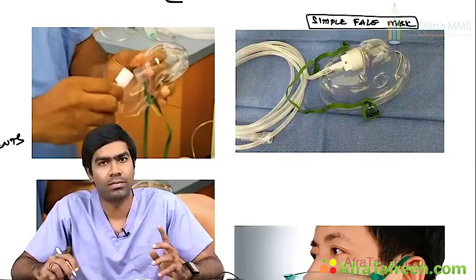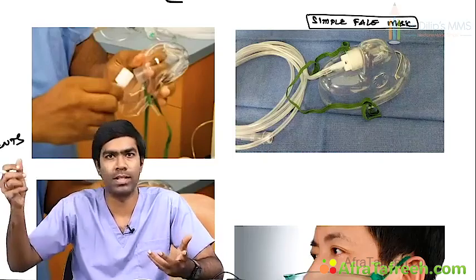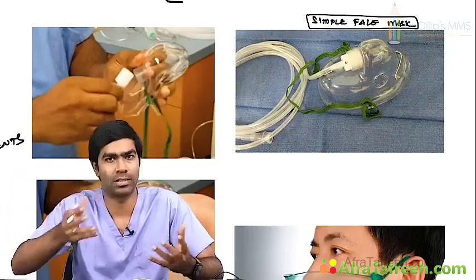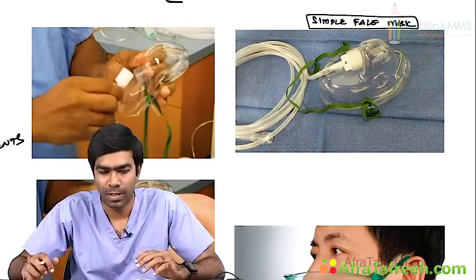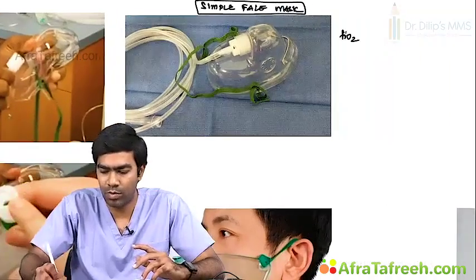Very simple device. It's just a mask like a nasal cannula only. Instead of the tubing, it will be the same. Just instead of the prongs, you'll have the mask. That's all. This is a simple face mask. And what's the FiO2 it can deliver? Again, unreliable, because this is a low flow device only.